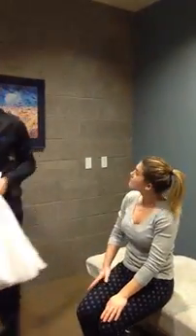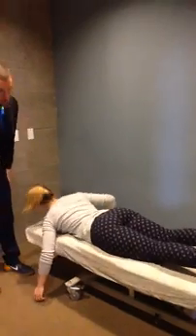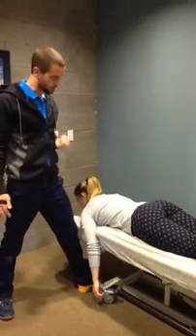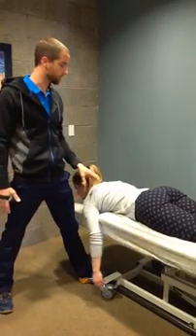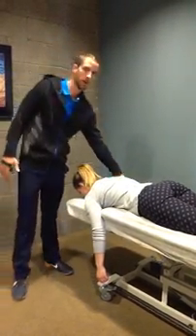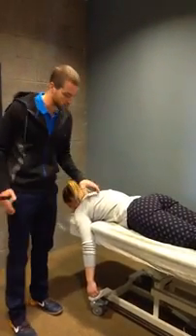The last one's for the shoulder. You're going to get her into prone. Prone on your belly for me, and in the bowl here. And actually come just to the side where that arm is dangling off the edge. So we're going to test 2 different scapular muscles, your mid-trap and your low trap. The key is the orientation of the arm and thumb. Before I continue going, we're trying to do our best to isolate here. So what I don't want to see is her legs lift off the table. I don't want her to hold onto the table. We're not doing gross assessments, more of isolated strength.